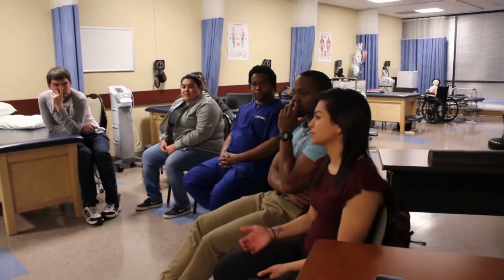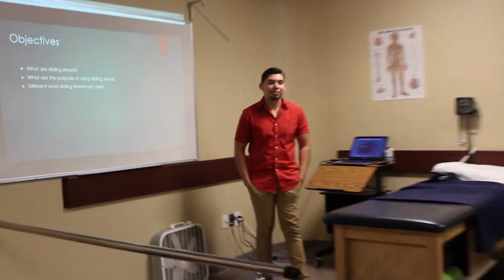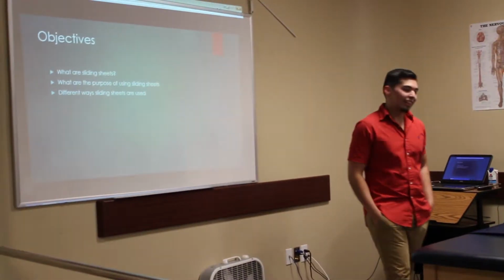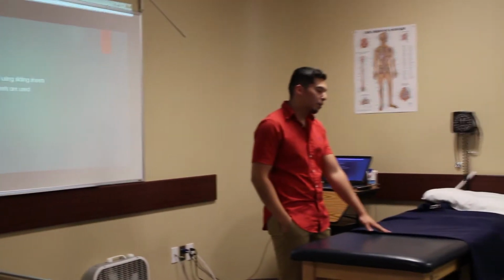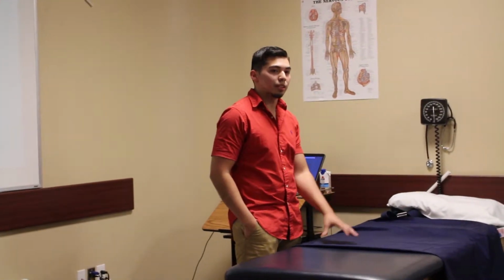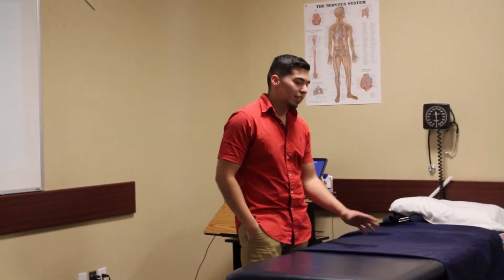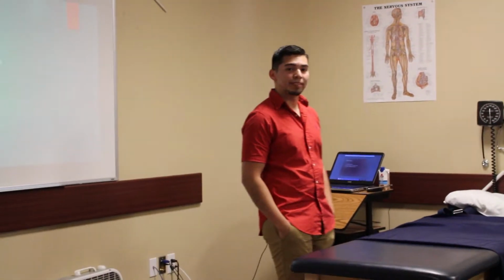Yes. Do you always have to use a gait belt, or can you just use the sliding sheet? No, the gait belt, yes, you need it all the time. It's just for safety precautions. It doesn't replace any gait belt or any transfer board. You do have the option of just using the slide sheet, but if the patient has a slide board available in his room and he's been using it for a while, then this just makes it a lot easier for him to do. Any more questions?